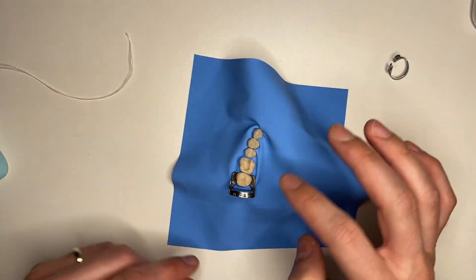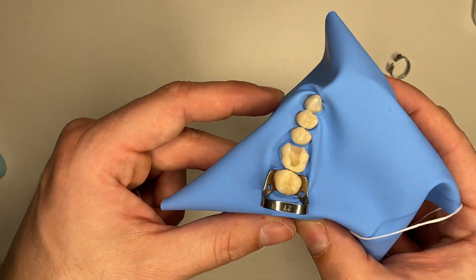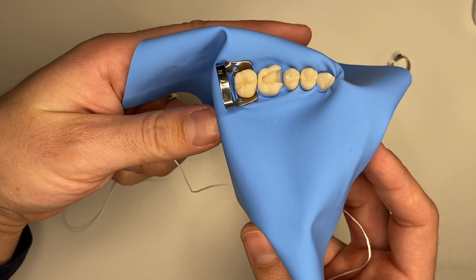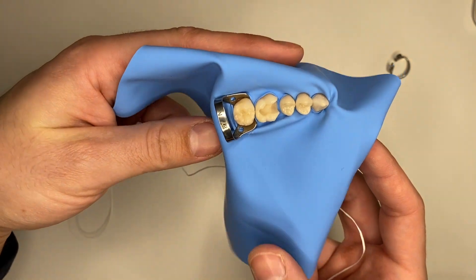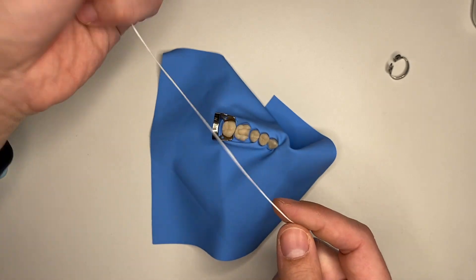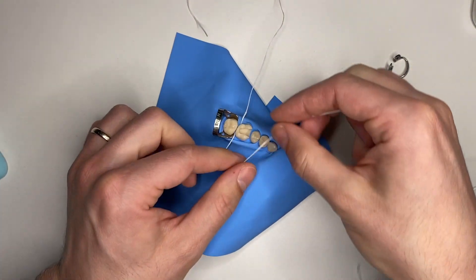Now you see the rubber dam seems to be crumpled here and there. I don't want this. This is not going to provide proper isolation. What I want to do is use my floss again, and I'm going to go around each tooth like this.